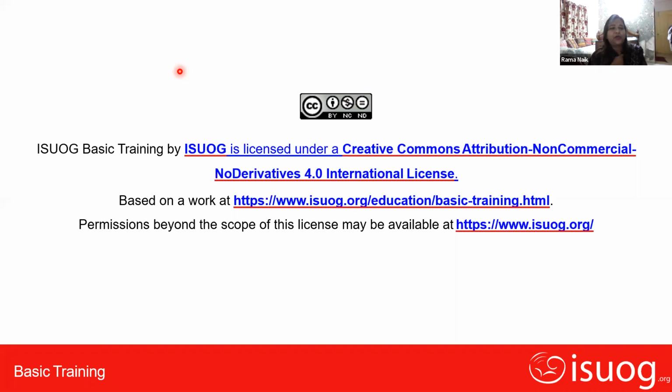Again, question number 2 is: what is not a criterion for optimal plane 6? Yes, please read it as optimal plane 6.